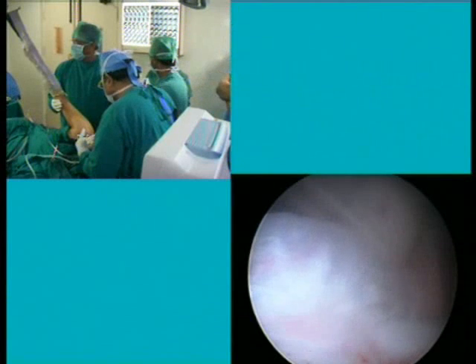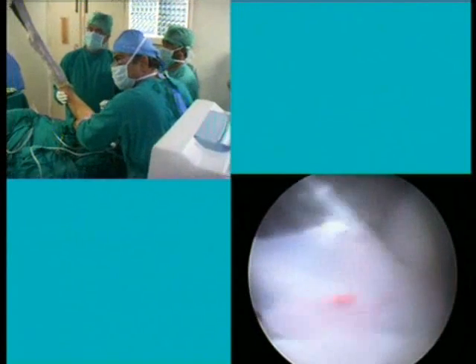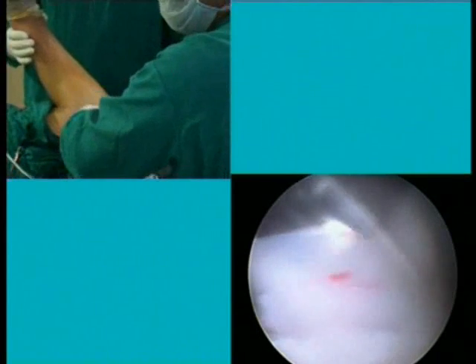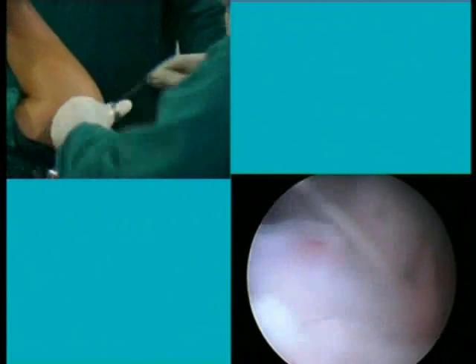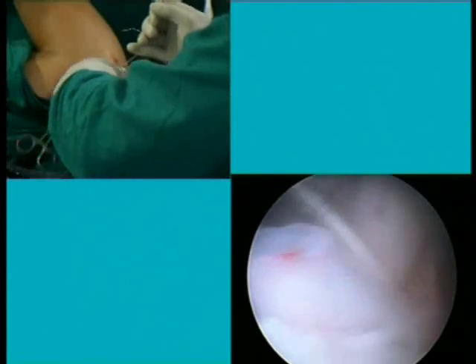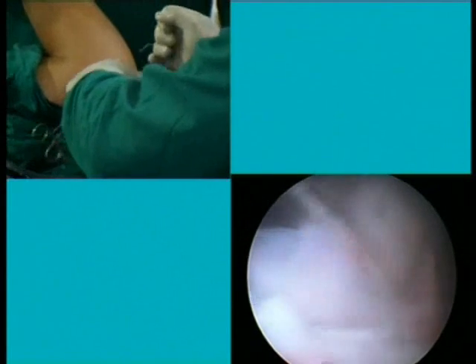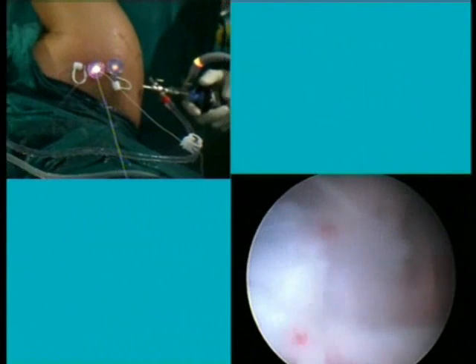The suture is very high strength and it does not abrade so easily. In India, we tend to reuse these plastic cannulas, and at times they have frayed edges. This kind of suture, which does not abrade easily by repeatedly shuttling the suture through the cannula, really helps us. So the water leakage can be prevented.